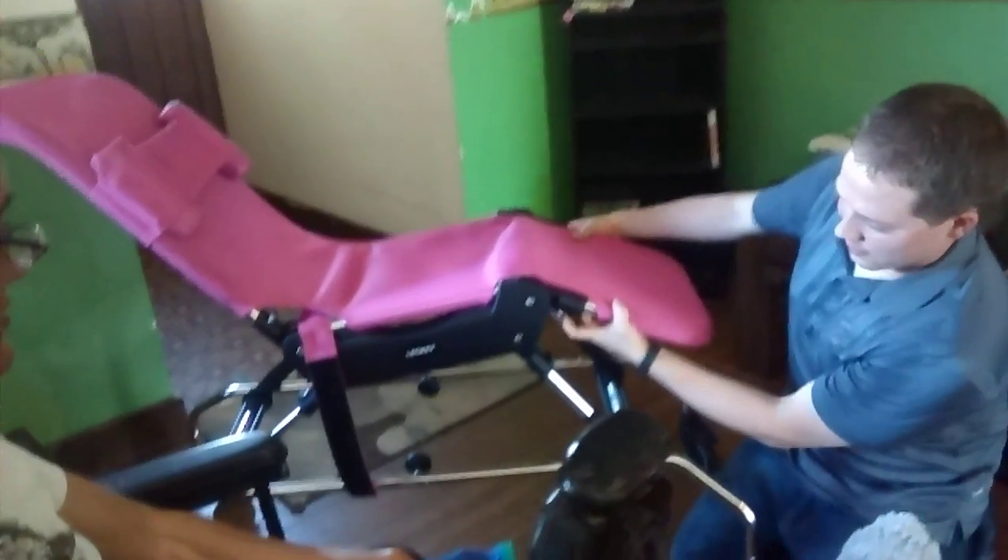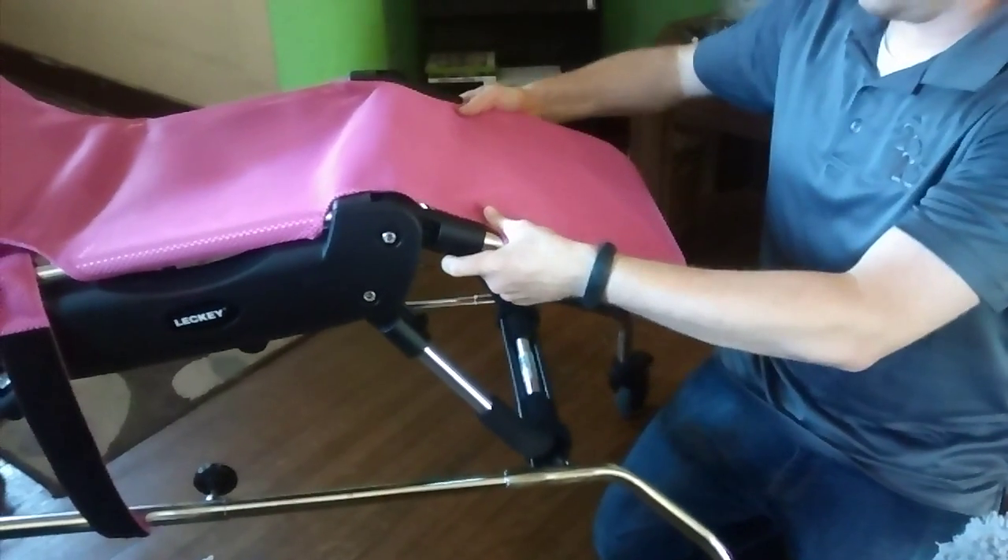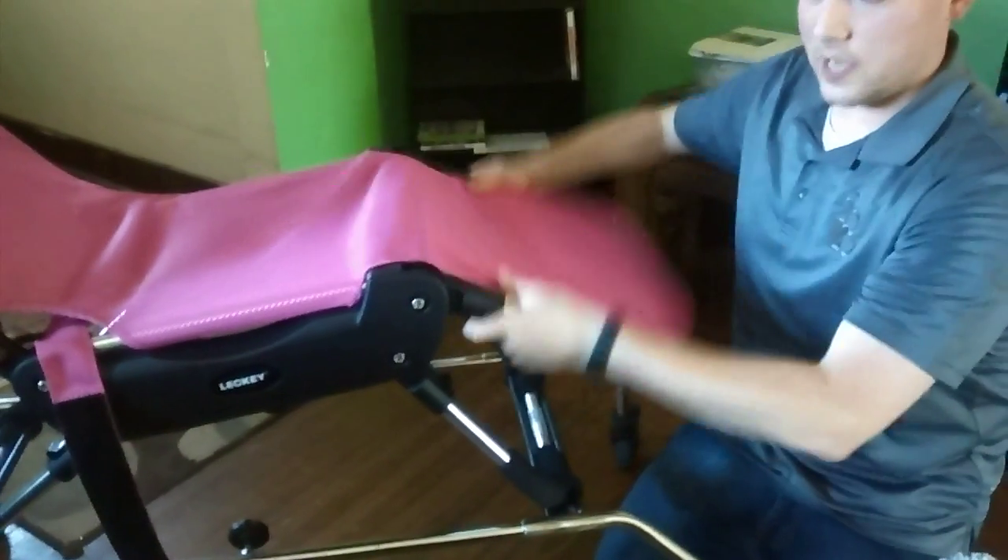If you need to adjust the legs, there's a button right here, just like that, and one on the other side. Pull that out and this will adjust up and down.